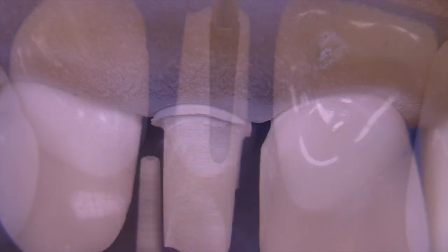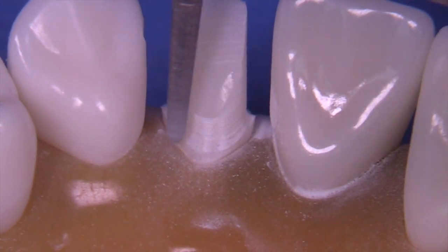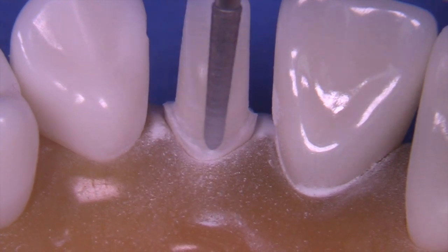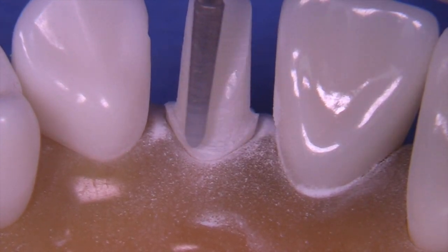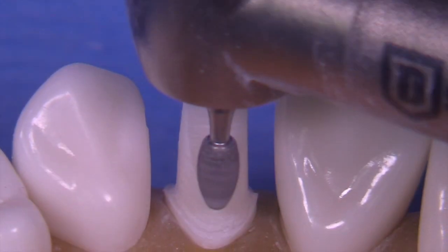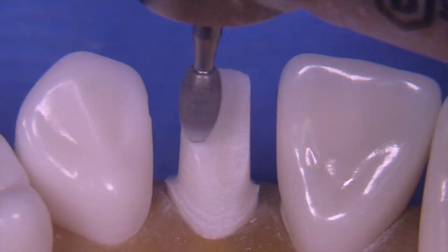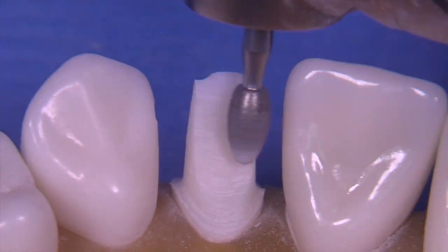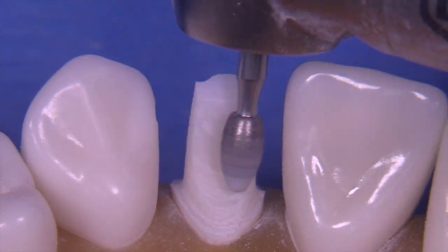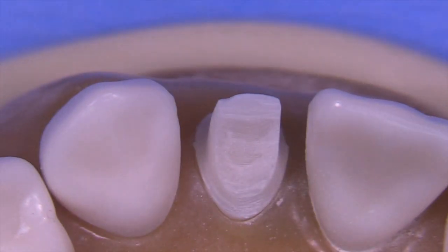Now let's take a look at the lingual reduction, exactly the same as we did on the central incisor — utilizing the chamfer-ended diamond called the 6878 K 016, which is a very effective and efficient bur. Then the lingual fossa, which has to be at least one millimeter reduced. We can use the tip of this bur to obtain the right amount of clearance reduction.